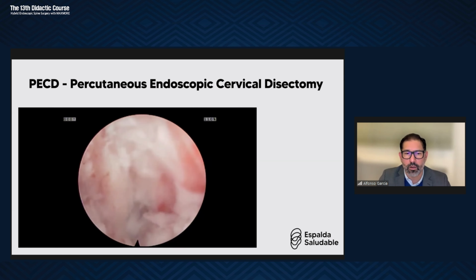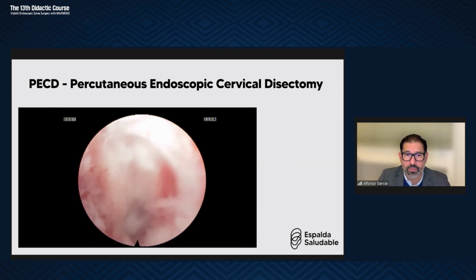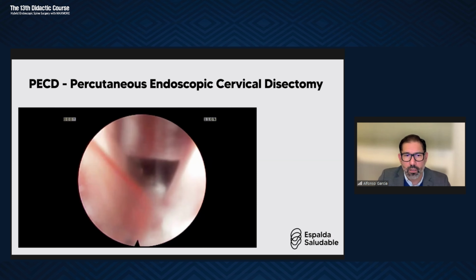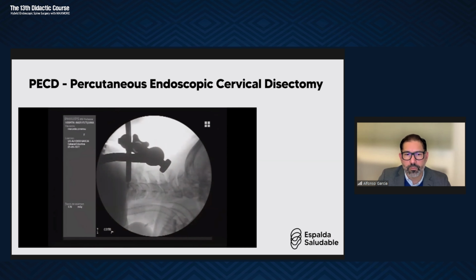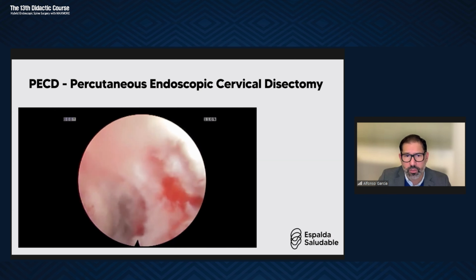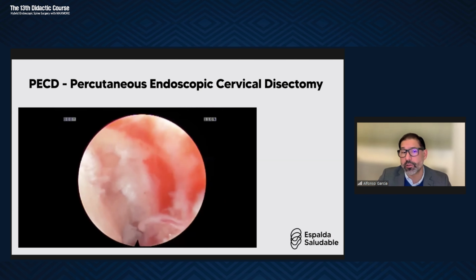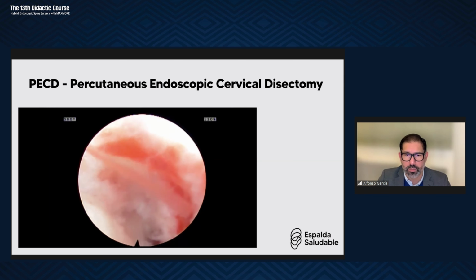I'm removing the herniated disc. You can see part of the pedicle there on the left side of your screen. I will let you know where it is. And as you can see, it is very clean and very forgiving with the nerve root because I don't have to use any retractors. You see the pedicle right there and the nerve root completely decompressed.